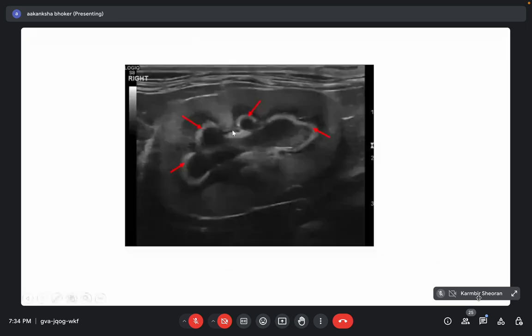So this is an example of the medullary rim sign, in which at the junction of the cortex and medulla, we will see some hyper reflectivity. These appear hyperechogenic, and it occurs generally associated with hypercalcemic nephrosis. And it is not much prevalent in Indian conditions, because most commonly it is associated with ethylene glycol toxicity, and it is generally not used in Indian scenarios. But in normal dogs also, which do not have any such problem, this medullary rim sign can be seen, and it is not a cause of much concern.